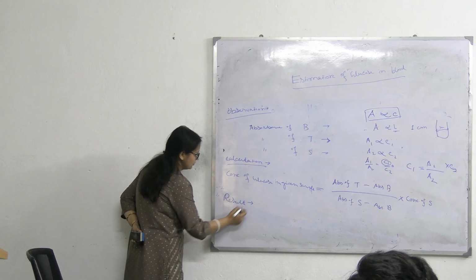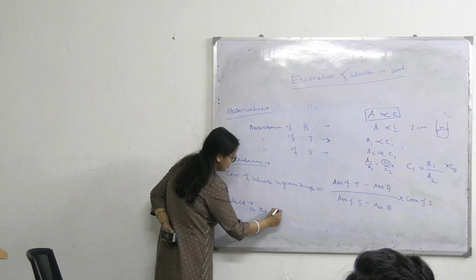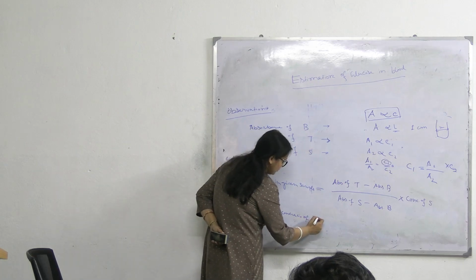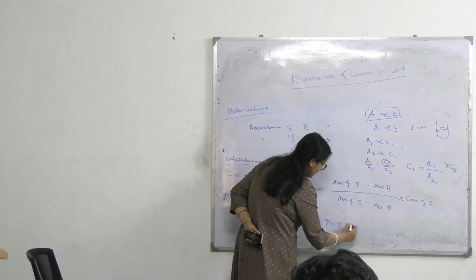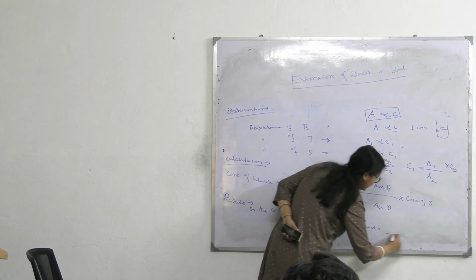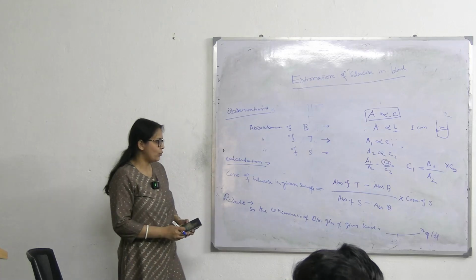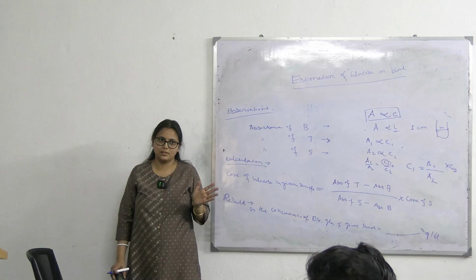Next, রেজাল্ট কি লিখবি? So the concentration of blood glucose of given sample is, যেটা পেলি সেটা, ইউনিট। What is the unit of blood glucose level? মিলিগ্রাম পার ডিএল, ঠিক আছে? রেজাল্ট হলো, এরপরে you have to interpret whether it is hypoglycemic sample or hyperglycemic, ঠিক আছে?